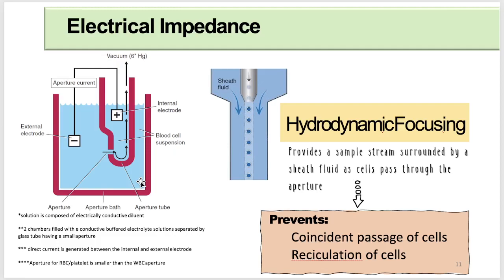We also use your hydrodynamic focusing. Ano yung hydrodynamic focusing? The use of hydrodynamic focusing avoids many of the potential problems, including your protein buildup. Bakit? Ano yung hydrodynamic focusing, Doc Von? It provides a sample stream surrounded by a sheath fluid as cells pass through the aperture. So, for example, ito yung aperture natin dito na area. Diba? This is the aperture.